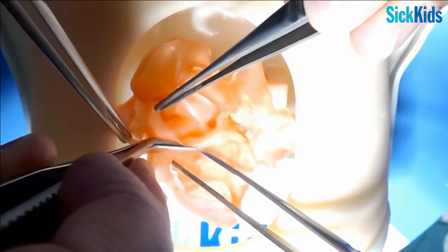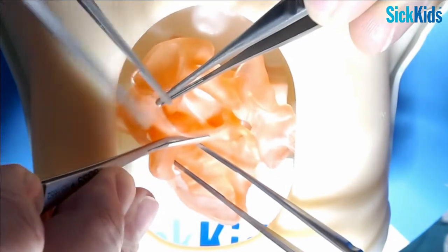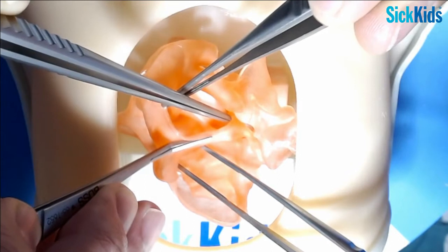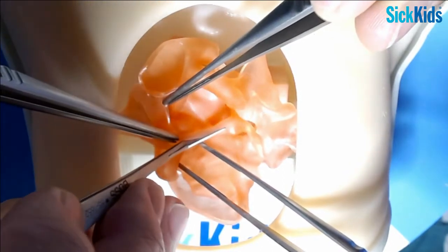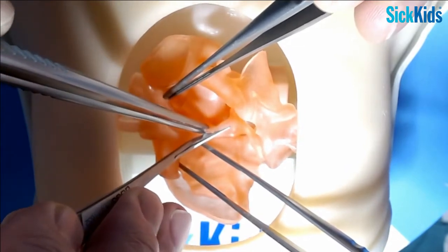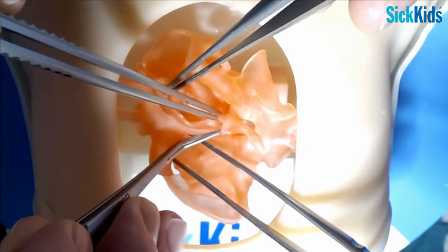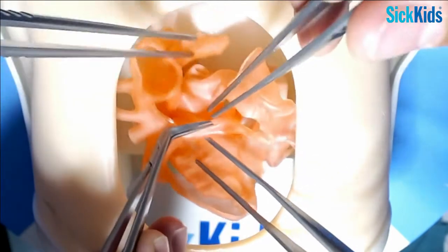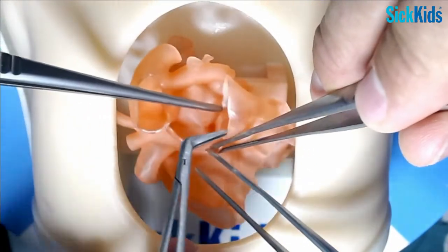And I move anteriorly as I get partway up the ascending aorta, because if you stay immediately on the side, you can compromise the left coronary that's right there. And you also want to know exactly where the right coronary orifice is, because you want to get close to them but not into them. Sometimes it's widening a little bit right there, which is nice to get into. See how that's starting to get a little bit wider? But you can see how you could potentially compromise the left or the right.